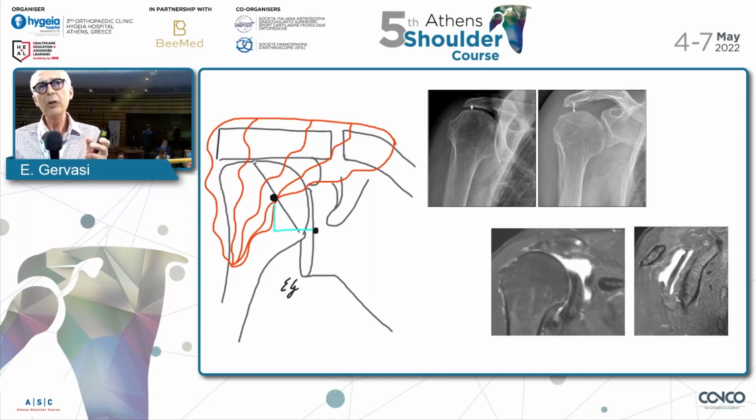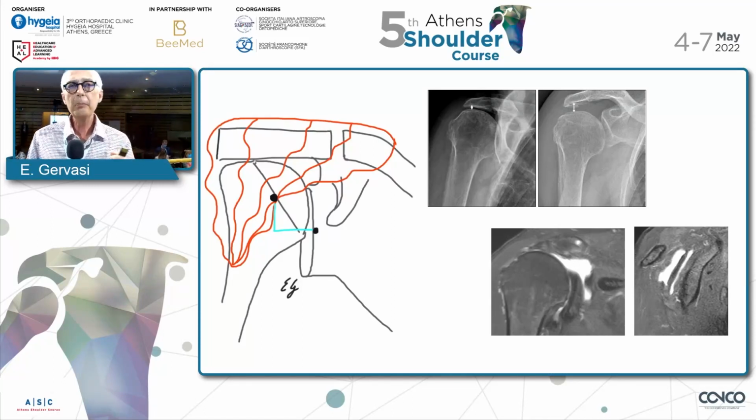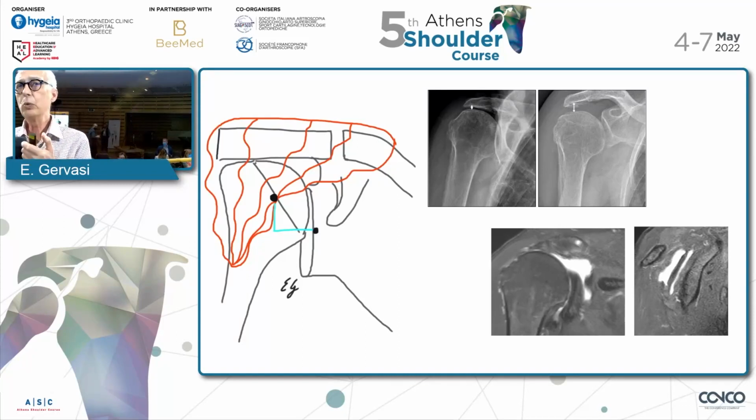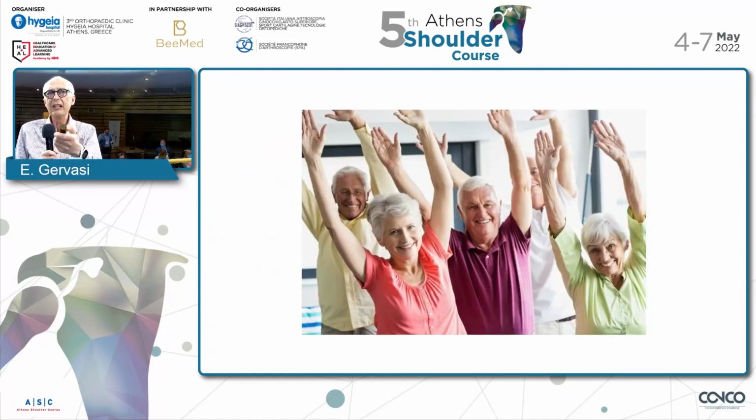What happens? We all know that when the cuff tear is massive, there is a proximal cranial migration of the humeral head, and the situation is worsened by the deltoid fibers that are not under tension. The humeral acromial space is a predictor of good function, because it shows whether you may have a healthy deltoid or not. These are the elderly people who can have a good procedure, even if the procedure is demanding.